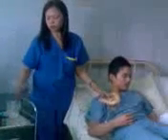So positioning the patient will prevent aspiration. Okay, then you can now check the tube for its correct placement. So first is aspirate the stomach content of the patient using a syringe.